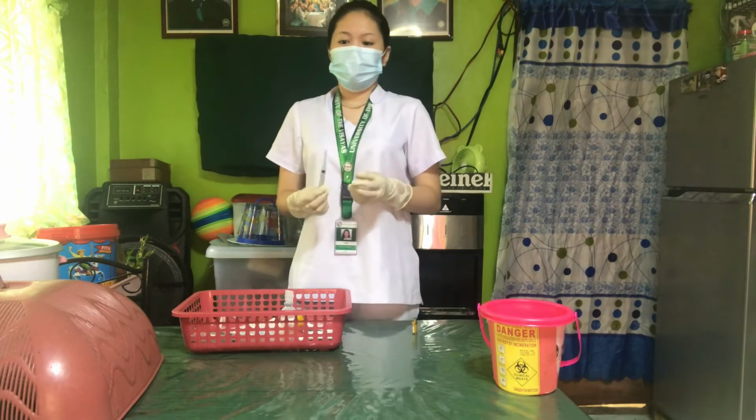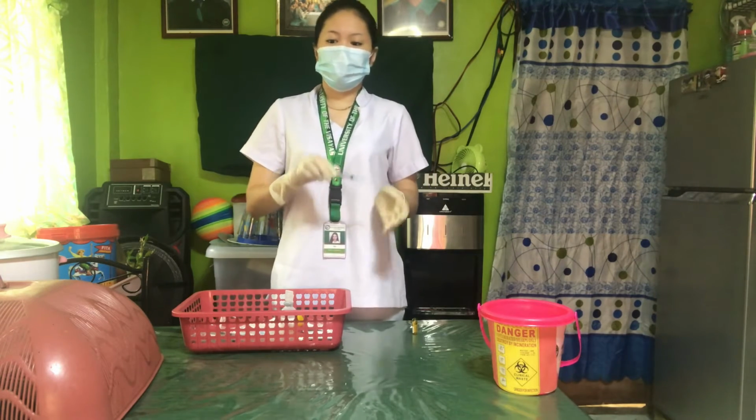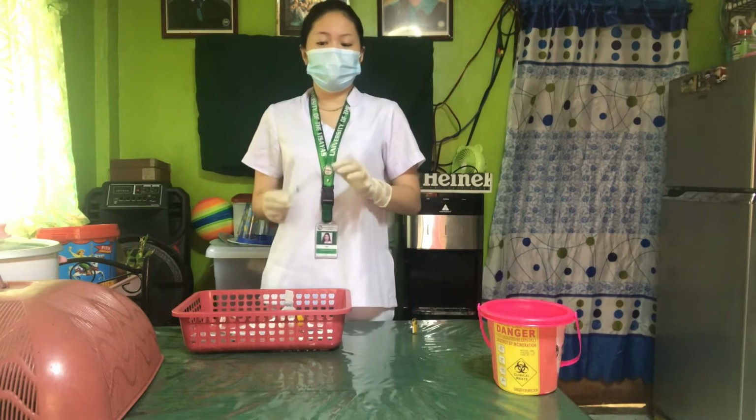So I am already attaching here the filter or withdrawing needle to my tuberculin syringe. Make sure that it is attached tightly, so as not to waste or leak the medication.